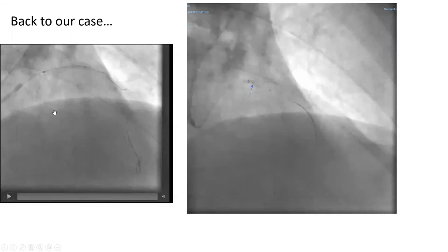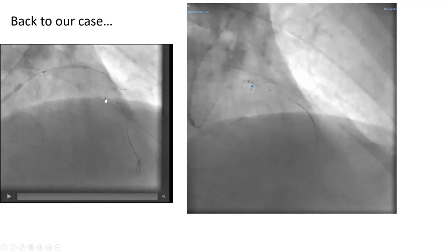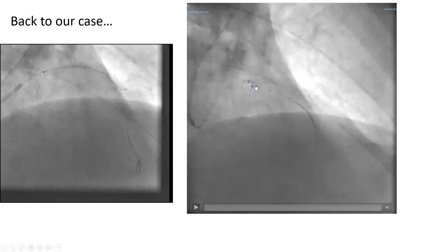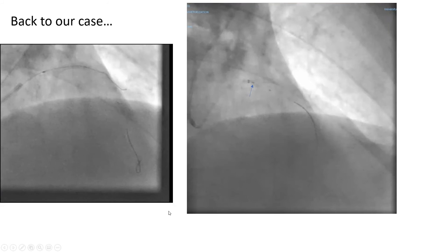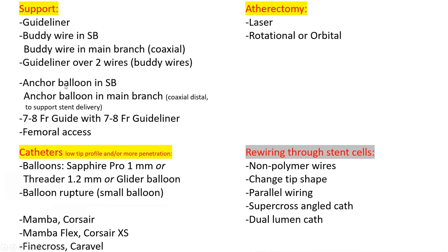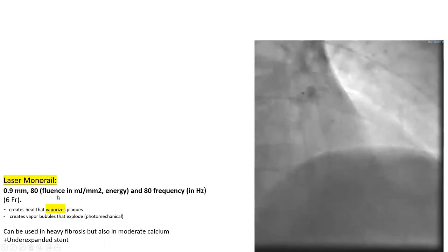Back to the case. We tried with Sapphire Pro, then MambaFlex, with the guideliner Amplatzing — no success. So we decided to do laser atherectomy, because I took into account that this patient likely has heavy fibrosis. Laser is a monorail catheter — the easiest atherectomy device to use. I use the smallest profile laser: 0.9 millimeter, which fits in a six French catheter easily. You can inject contrast around it as you position it.